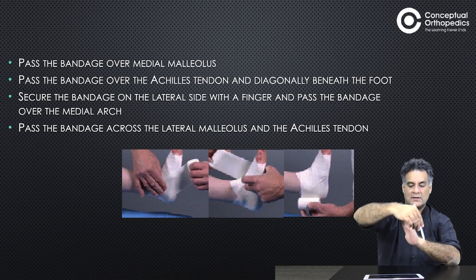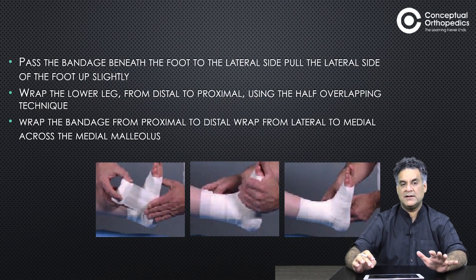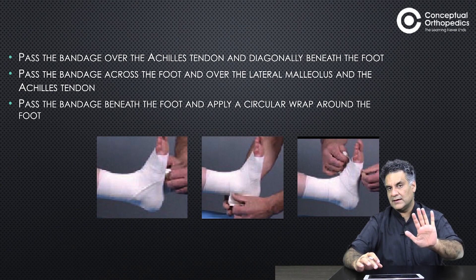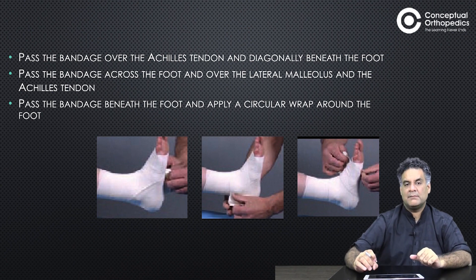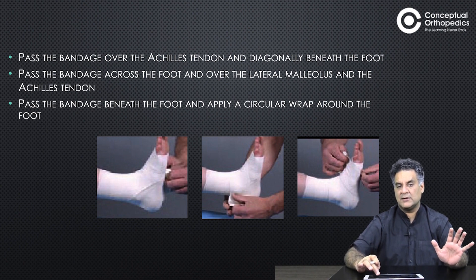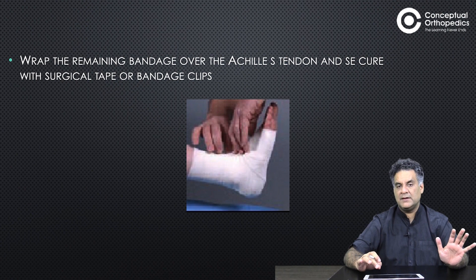Keep on rotating — one, two, three, four passes — with padding at the malleolus. Pass it behind the foot to the lateral side and pull the lateral side of the foot up slightly, aiming for a little eversion. Wrap the lower leg from distal to proximal using the half-overlapping technique. Wrap from proximal to distal, from lateral to medial across the medial malleolus to ensure a slight raise on the lateral margin of the foot. Pass the bandage over the Achilles tendon and diagonally beneath the foot; go over the lateral malleolus ensuring the Achilles tendon is well protected.